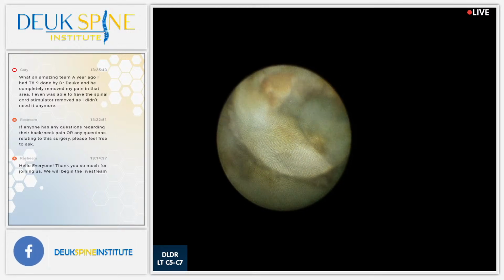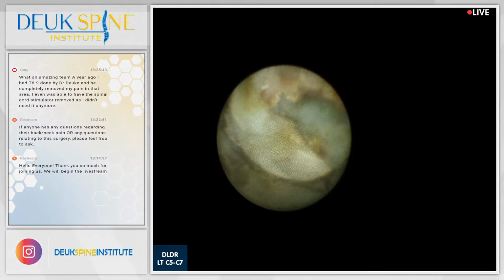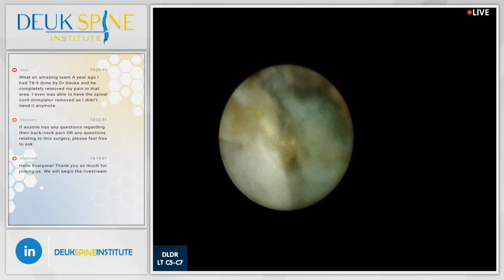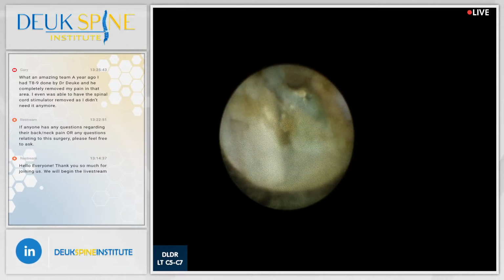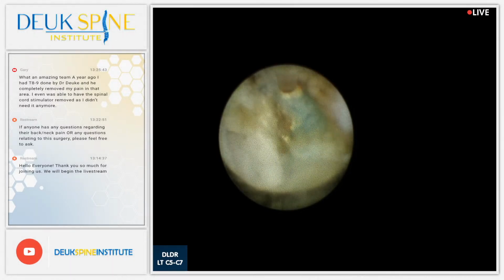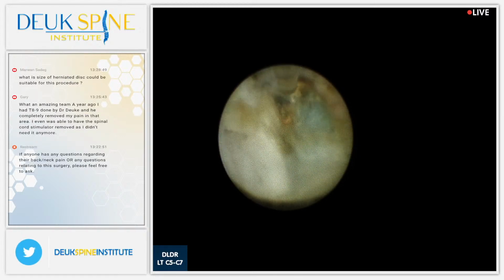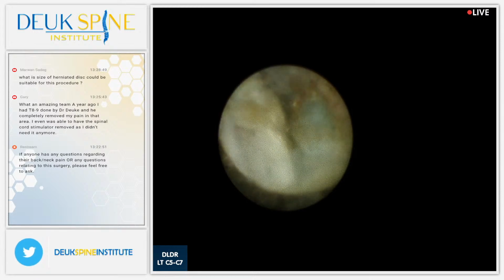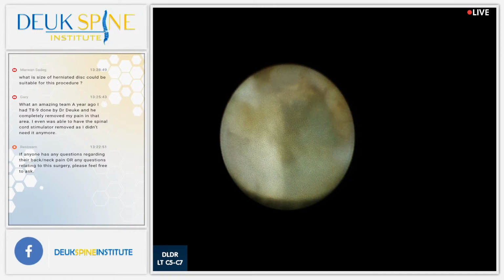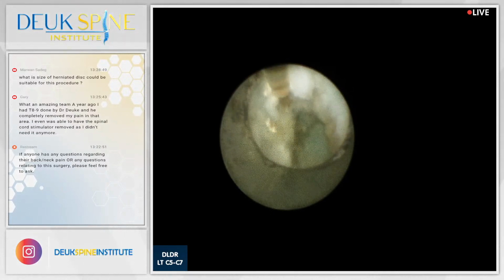We just did 2 thoracic DLDRs last week, one on Tuesday, one on Thursday. By the way, look here. That is the herniation. You can see now that I'm removing it, you're starting to see a little bit of herniation left still. I'm going to get that too. But the beauty of this surgery is that we don't remove your disc, so you don't need a replacement of your disc. We also can see exactly the herniation, and I can remove it, literally taking away 0.05 millimeters at a time. That's how precise this surgery is.